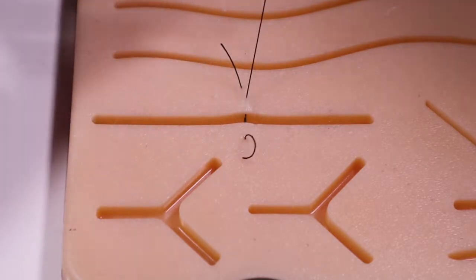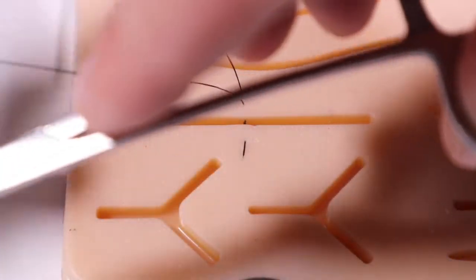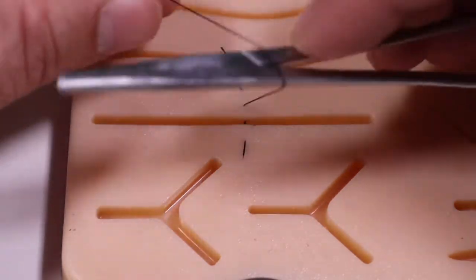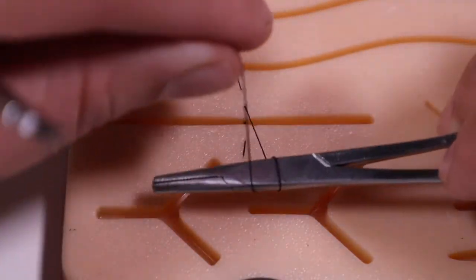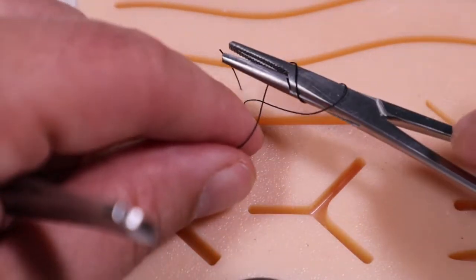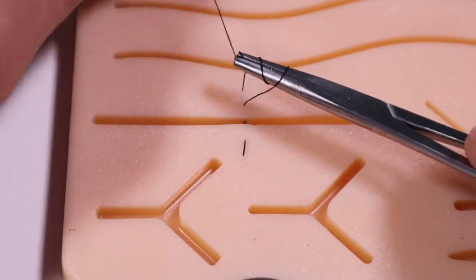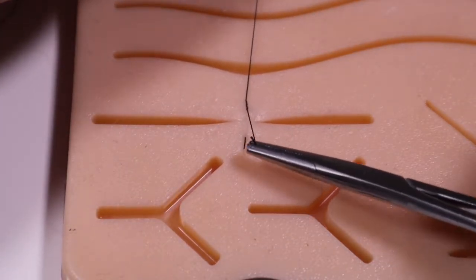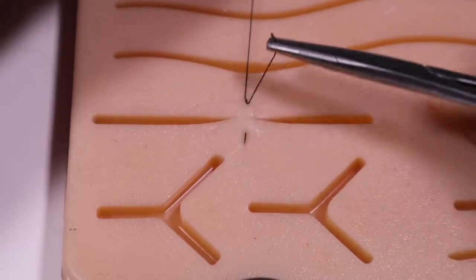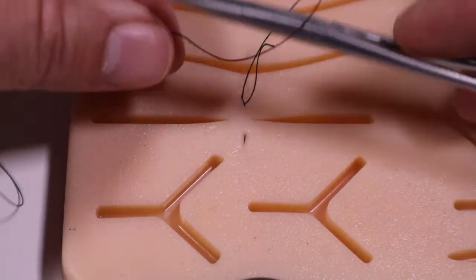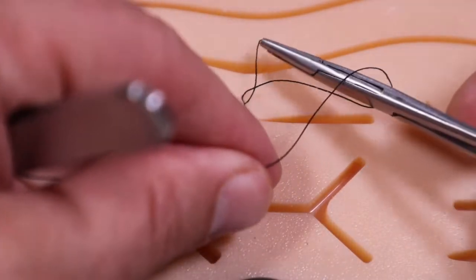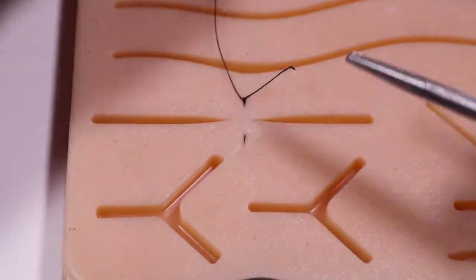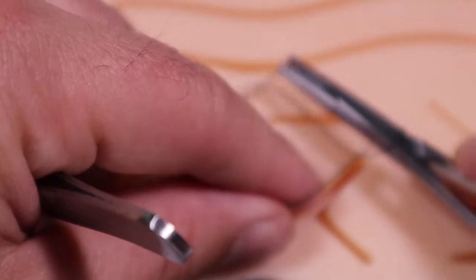So you'll cinch that down and then you'll tie just as you do any other with two forward throws around your needle driver. Grab the tip of that needle driver and pull down, tighten that edge down and cinch it up, and then one reverse and then another forward.